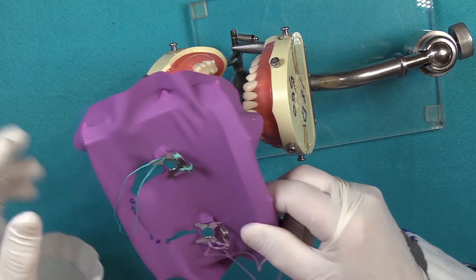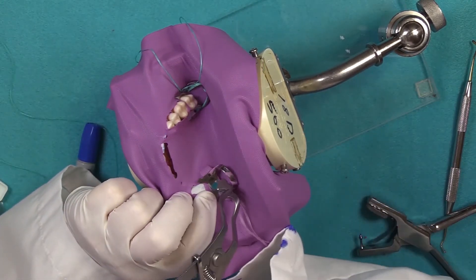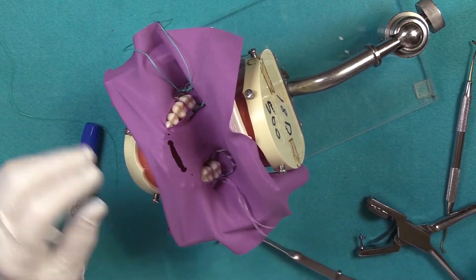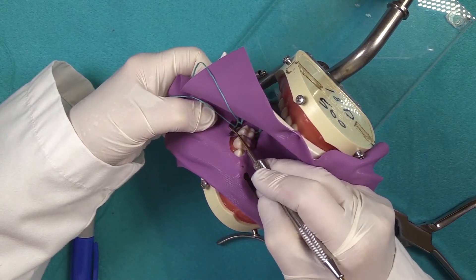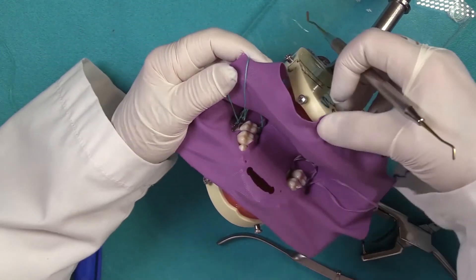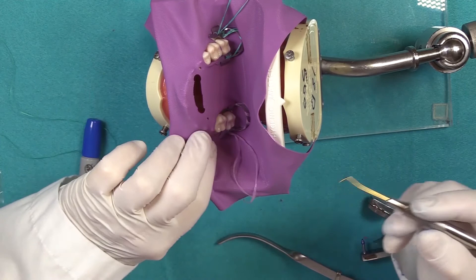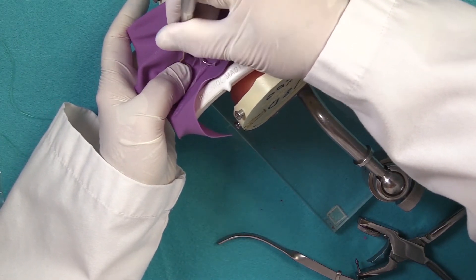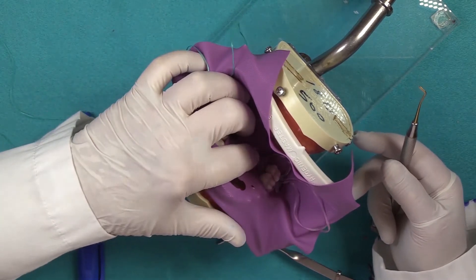Now we're ready to go to the mouth. We're going to seat our clamps first, then stretch the dam off the wings, making sure to use the side of the instrument. On wing one, stretch it off the wing with your finger, then come over and stretch the dam off the other wing, using your index finger to stretch the dam off the lingual aspect as well.